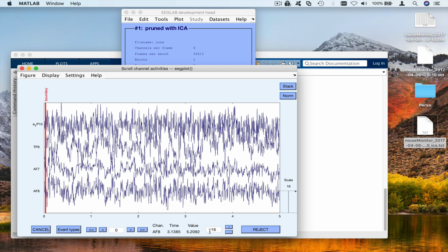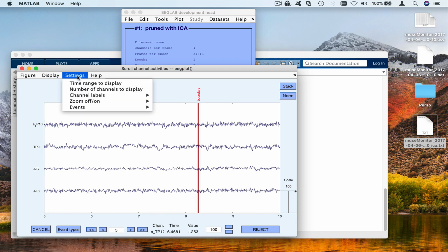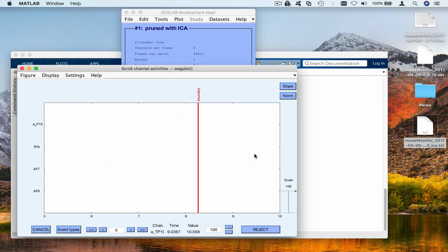I change my scale to 100. I have a little bit of data here. You know, it's not removed, so I'm just going to select it again. I don't like to have a boundary here with just a little bit of data. And now I'm going to take my range to 30 seconds as well.